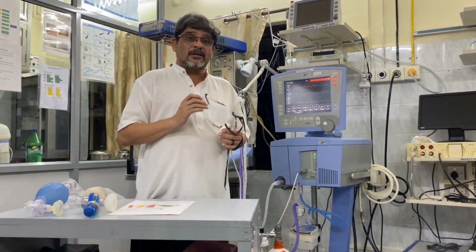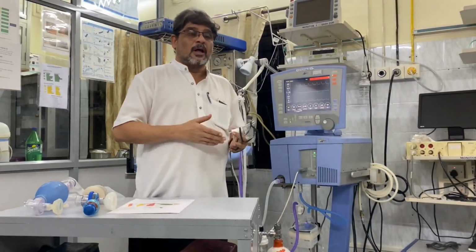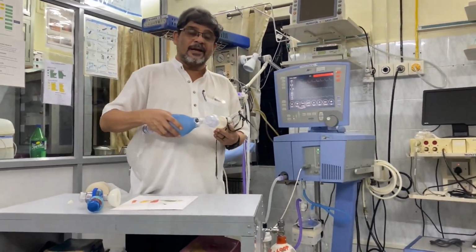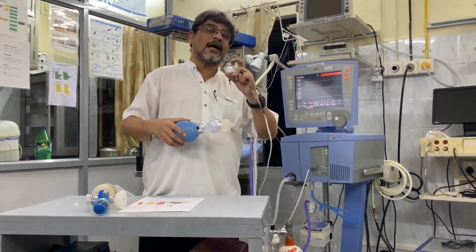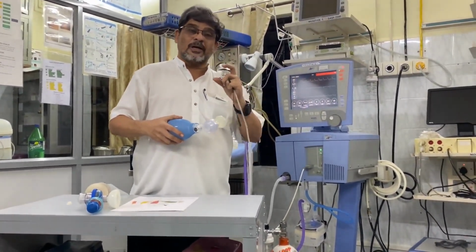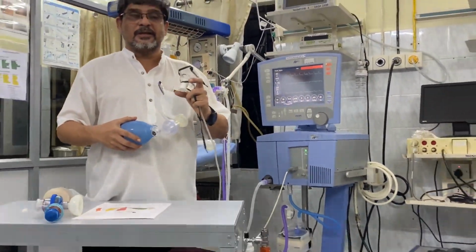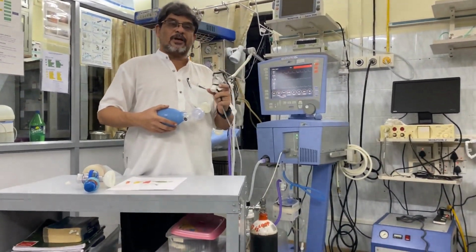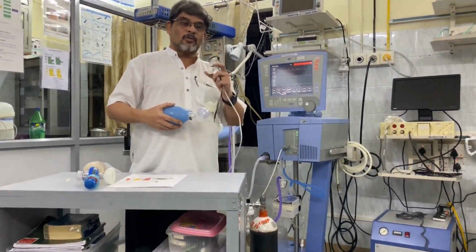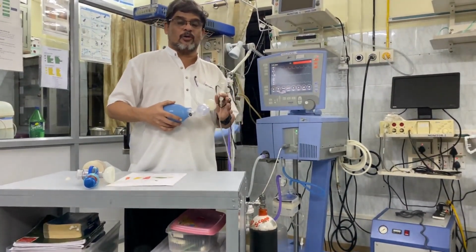Now what about ventilation? Ventilation is a function of tidal volume or minute volume. How much air goes into the baby and comes out of the baby with each breath is known as tidal volume. So the normal tidal volume which we keep on the machine is 6 ml per kg. That is the ideal tidal volume. Although the tidal volume in small children can vary from 4 to 8 ml, in adults and older children we try to keep 6 ml per kg as the tidal volume.